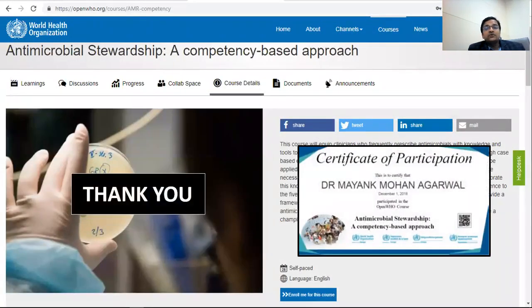And the time has come to judiciously use antibiotics. In our practice, we don't use antibiotics systemically. We always get the culture done. If there is infection, we treat it beforehand, 2 days before. During the study, in such cases, we use amikacin in the filling fluid, and we discharge them without any antibiotics.